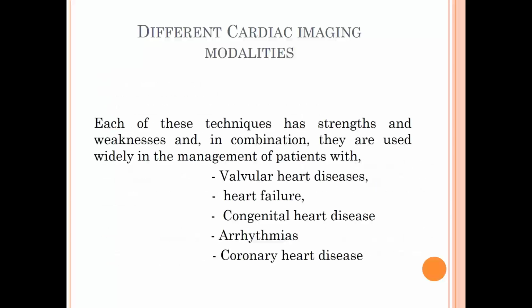Each of these techniques has strengths and weaknesses, and in combination they are used widely in the management of patients with valvular heart disease, heart failure, congenital heart disease, arrhythmias, and even coronary heart disease.